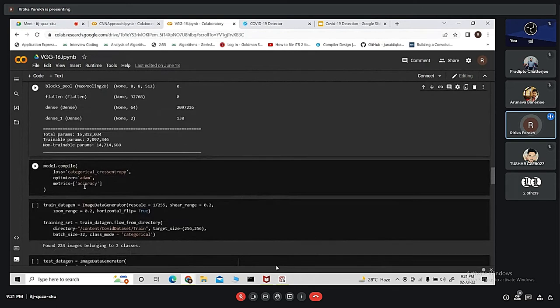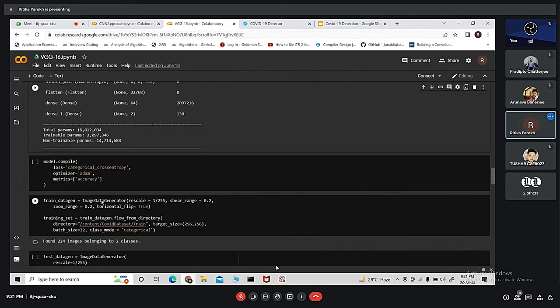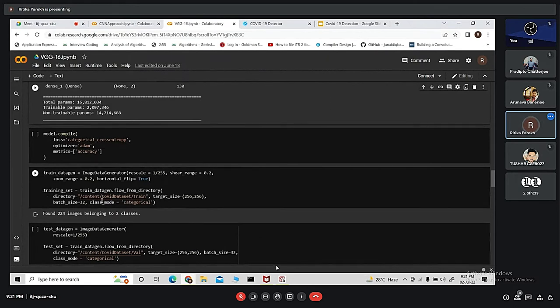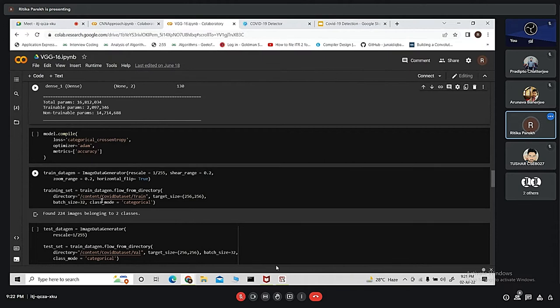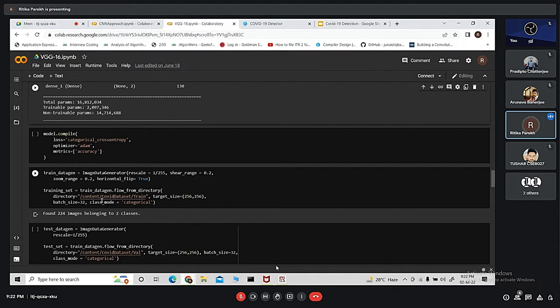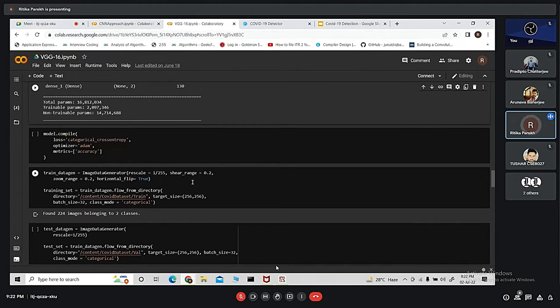Next, we are compiling the model using model.compile method. We are using loss as categorical cross entropy and optimizer we are using Adam. Metric is accuracy. Next, we are using image data generator function. This function is used for augmenting images. Augmenting means generating different versions of similar image based on some parameters. For example, rescale equals to 1 by 255, shear range 0.2, zoom range 0.2 and horizontal flip is true.